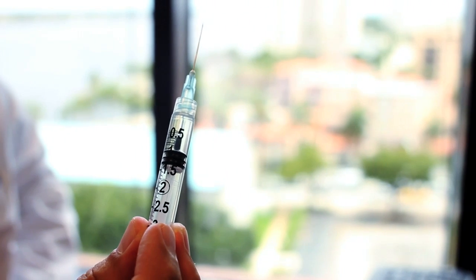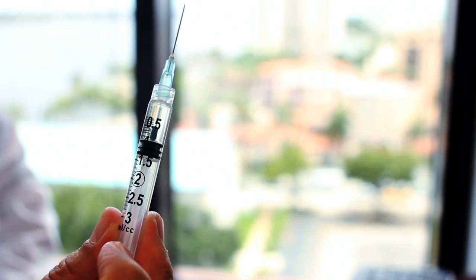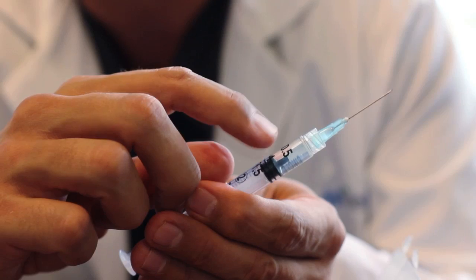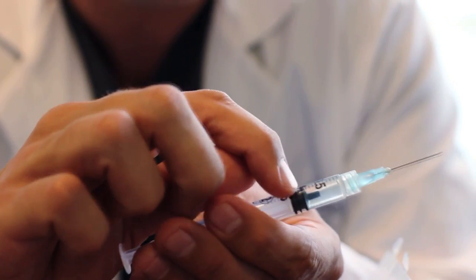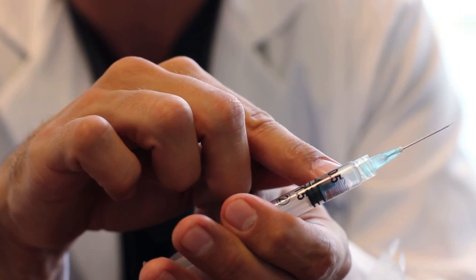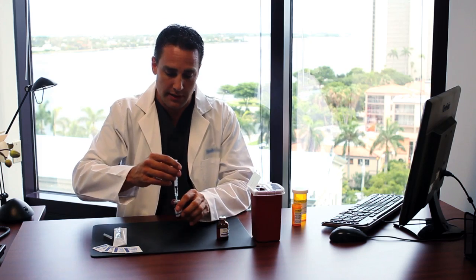In other words, to properly measure the correct dosage, you want to use the first black line, and that black line is the top of the plunger, where it's the first point that actually touches the inside of the glass. Looking closely, you can see that the black line perfectly lines up with the 1 cc mark, but on the inside of the 1 milliliter mark is the concave point. Again, the proper way to line this up is at the first line underneath that point where the plunger first touches the inside of the syringe. Once you've established that that is correct, invert the testosterone, remove the needle, and you're ready for injection.